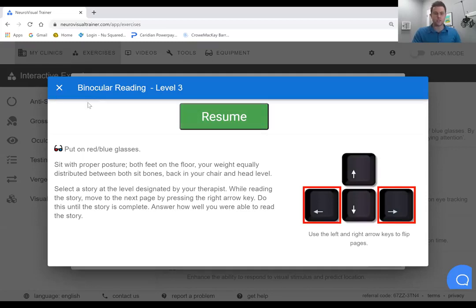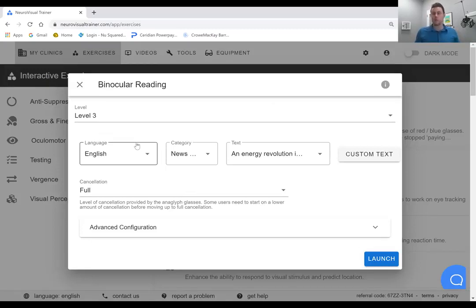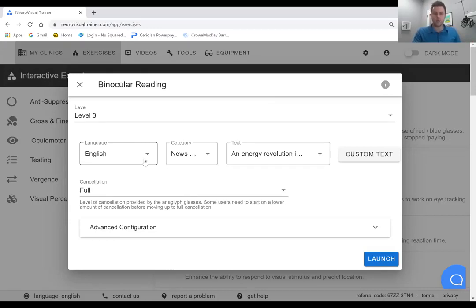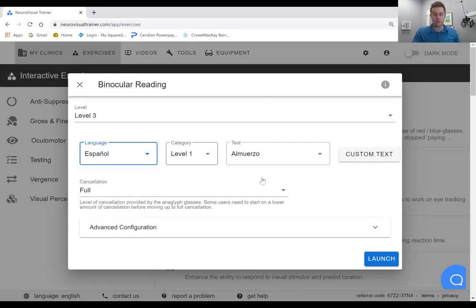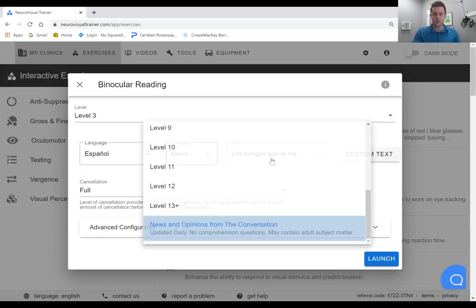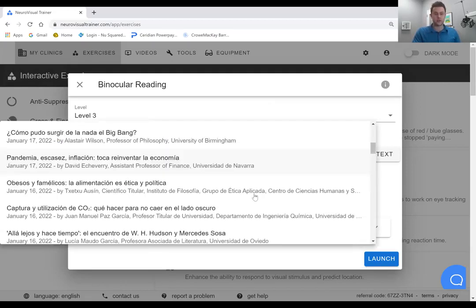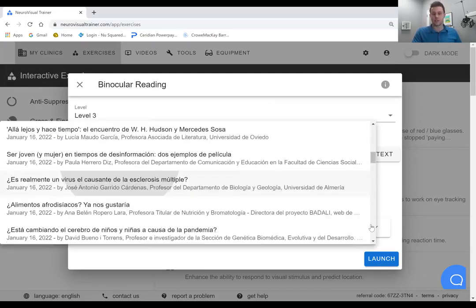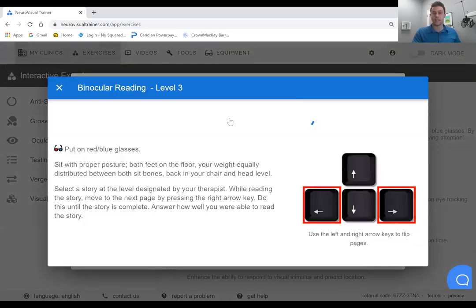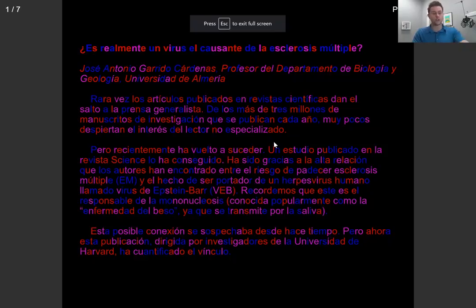We had a chance to look at this here. But we've talked about it being available in English. A lot of the neurovisual trainer users might have many clients whose first language is not English, and they would prefer to read stories in Spanish or French. So you can go ahead and pick from the same news source, choose a story here in Spanish, and launch it. It's going to work exactly the same as we previously saw with the English version. And you're also going to be able to get that with French.